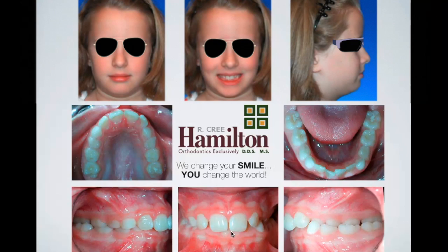Look at the facial rest photo. Do you see anything in the facial rest photo as far as symmetry goes? Yeah, maybe off to the left a little bit. So my question is, do you hope that this patient has a CRCO slide? Got some head shakes, yes. Why do you hope that they have a slide?